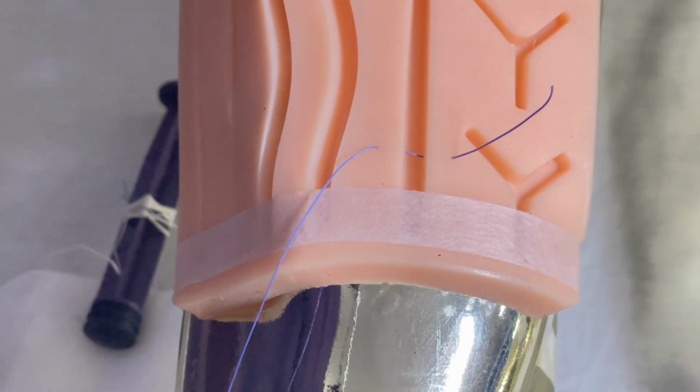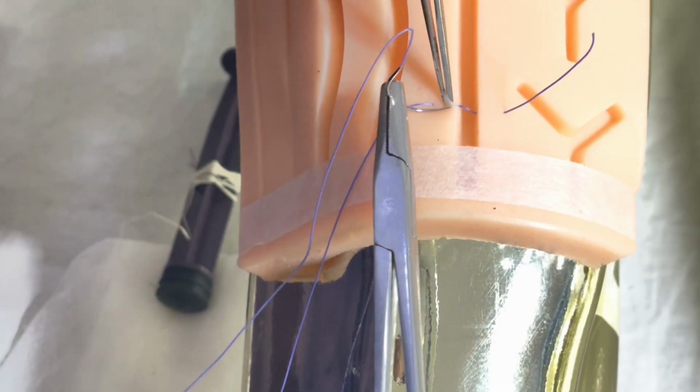Then rotate the needle in the opposite direction, and now for the vertical mattress, it has to be closer to the edge. In this manner.